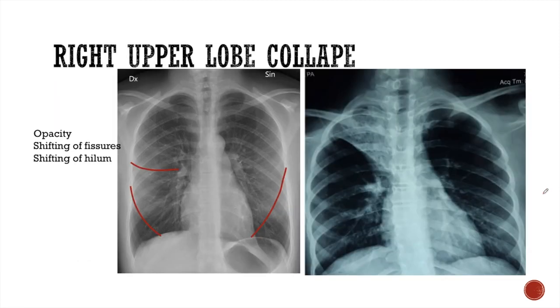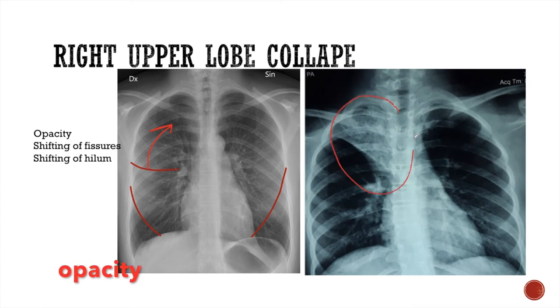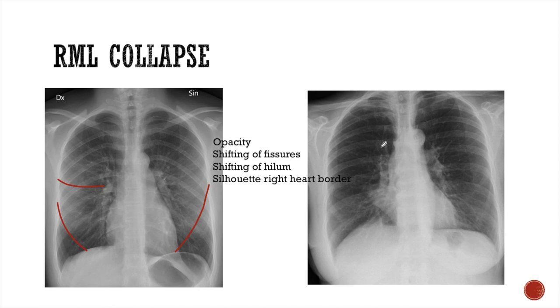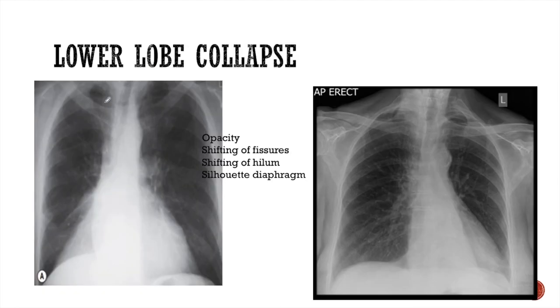In right upper lobe collapse, the right horizontal fissure is shifted upwards. There will be opacity in the right upper zone, the fissure shifts upward, and the hilum is also shifted upwards. In right middle lobe collapse, the fissure shifts towards the collapsed lobe, and we see a triangular opacity in the right middle zone. There is loss of the interface of this opacity with the right heart border — this is characteristic of right middle lobe collapse. In right lower lobe collapse, there will be triangular opacity in the lower zone with loss of interface of the collapsed lung with the diaphragm.